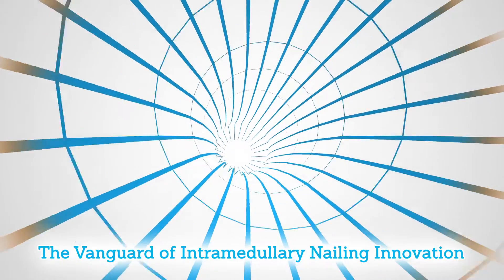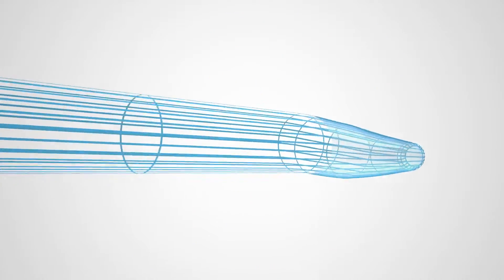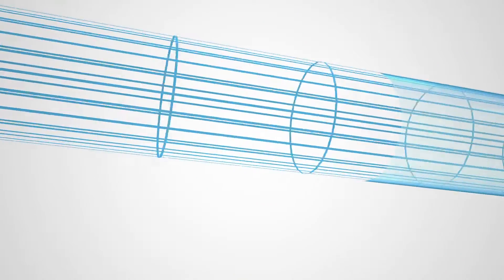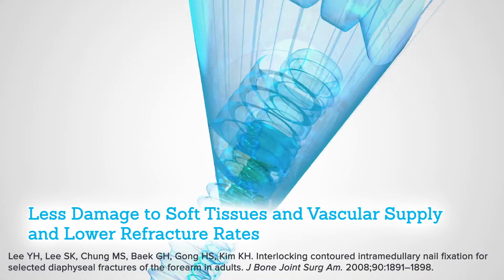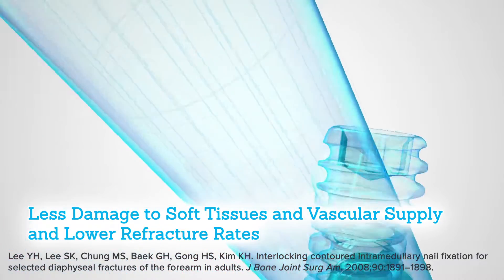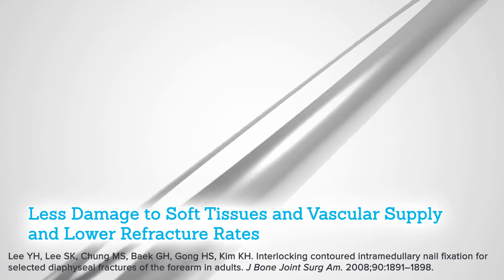The Acumed ulna nail 2 represents the vanguard of intramedullary nailing innovation. The ulna nail 2 is designed to treat ulna fractures through a minimally invasive technique. The intramedullary nailing technique has been shown to result in less damage to the soft tissues and vascular supply, as well as lower refracture rates when compared to open reduction internal fixation with plates.